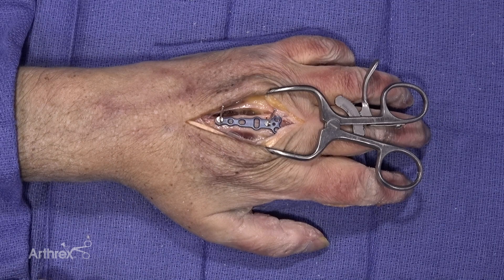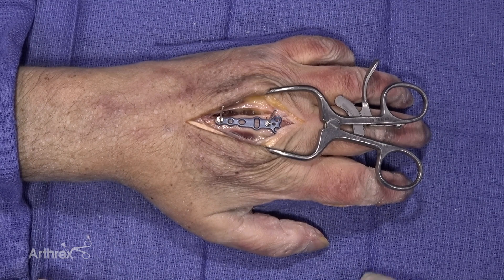Hello, my name is Mike Garcia. I'm from Tampa, Florida. I'm a hand and upper extremity surgeon at Florida Orthopedic Institute. Today, I'm going to demonstrate the rotational correction plate in the mini comprehensive fixation system.